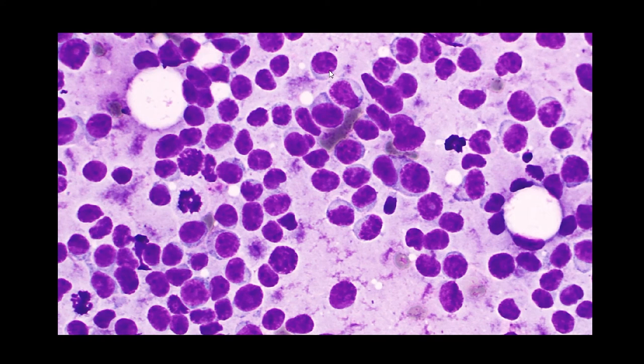Notice, but there's a couple of elongate looking nuclei here that you wouldn't normally see in most lymphomas. Just notice while I'm here there are two mitoses standing out, and the background often contains mitotic figures and apoptotic debris and necrosis, because these are often quite aggressive, rapidly proliferating tumours.